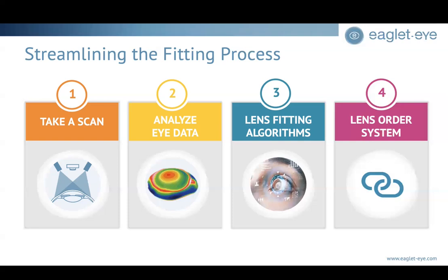We can use the data that we generate to send straight to a lab to have them do the calculation for us, or within software, which I'll talk a little bit more about, we can do the design ourselves. So there are fitters out there, myself included, depending on the day. Sometimes in the clinic when it gets really, really busy, the last thing, if there's 10 orders sitting on our desk, that we have time to do is go into software and design every curve and everything on our own. Some days we want to do that.